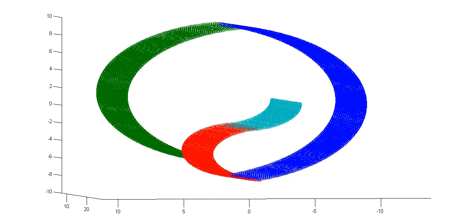And if you try to map the organization of these response properties across the surface of the brain using lots of different techniques, including fMRI, then for many different properties you see that they have some structured organization. It's not random. So one simple confirmation of fMRI techniques is that you can verify that fMRI can accurately measure visual maps in monkeys by also using a more direct technique, like electrophysiological recording from the monkey's brain, and that works.